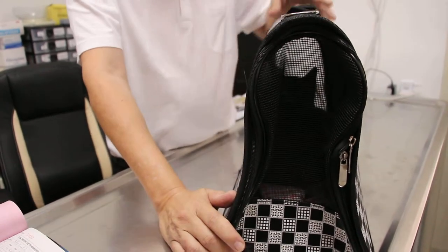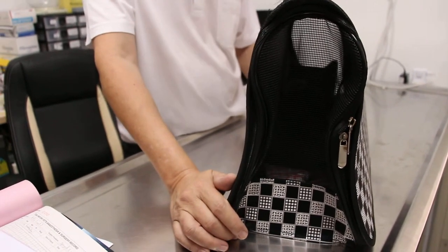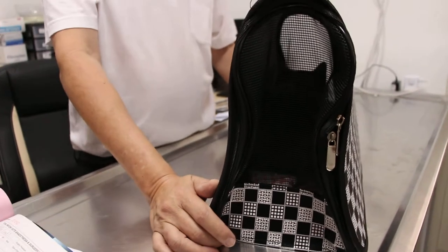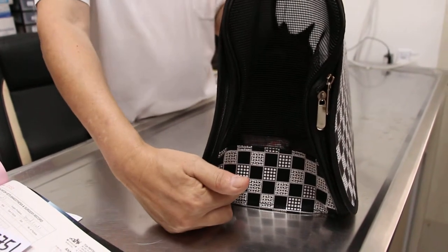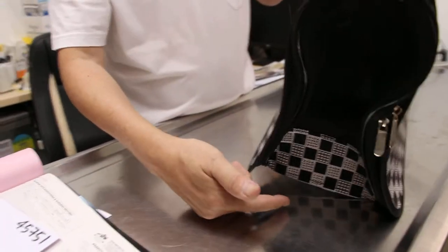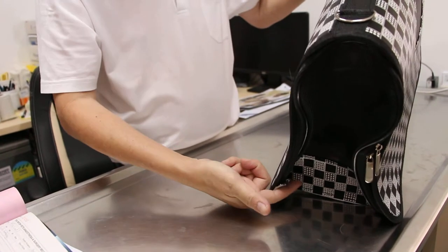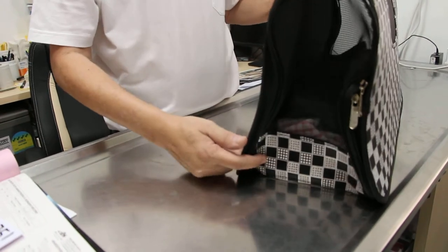So this is one of those cases where sometimes you have to use your common sense to handle the cat. The other way, of course, is to put the cat in the carrier and inject him on the backside. Some clinics don't have anesthetic gas, so they tilt the cage — the cat slides down to one end — and then inject the cat on the backside through the space in the cage, so that the cat sleeps.